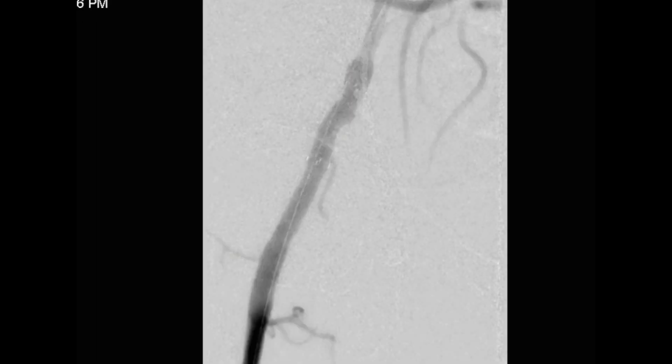Repeat angiogram then demonstrated resolution of the stenosis and brisk flow through the iliofemoral system and a three-vessel runoff to the foot.